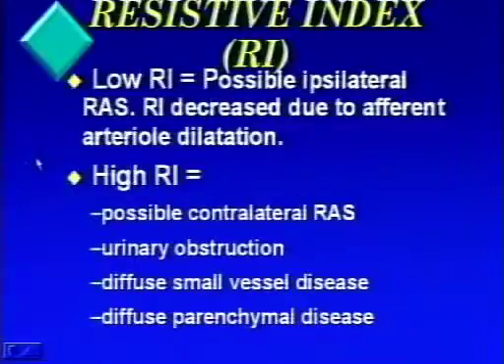What I have found is that in most labs, if they are comfortable with the direct method and they're not familiar with the indirect method, they will do both examinations initially until they can get some good QA performed and demonstrate that they're getting accurate results with the indirect method. And once that's been achieved, then they will move on to doing the indirect method first and only doing the direct method as a way of concluding that there is a significant stenosis if the results are equivocal.